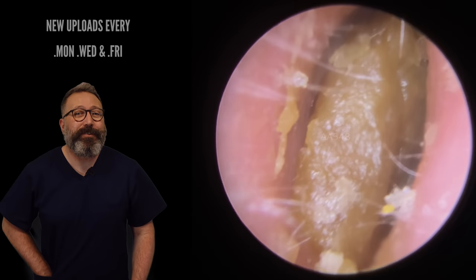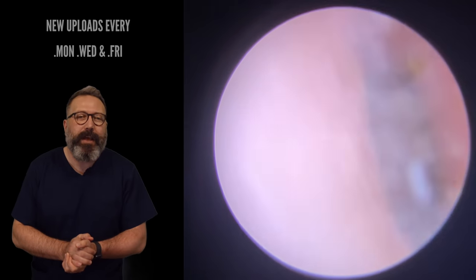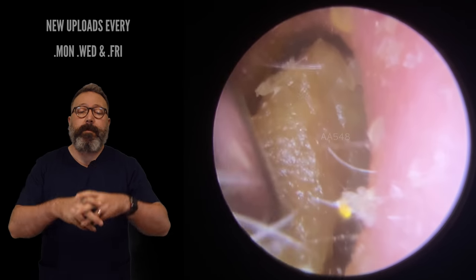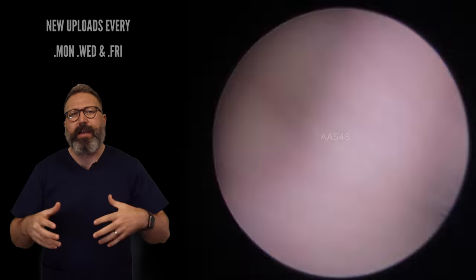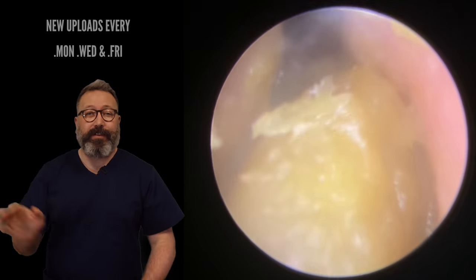Hi everybody, this is Rhys Barber from Audiology Associates. Welcome to Friday's ear wax removal compilation video for today. I hope we've all got that Friday feeling, guys. As you can see, this first patient here has very tough old wax — it's really dry. The suction tube just kind of buffed off it, like, no way.